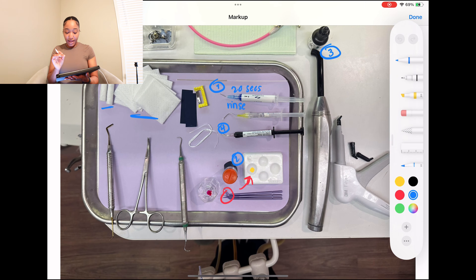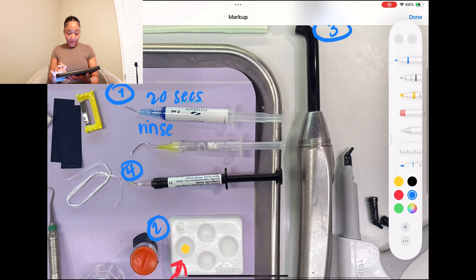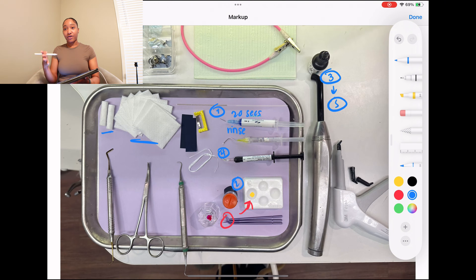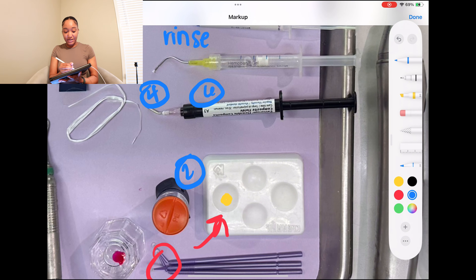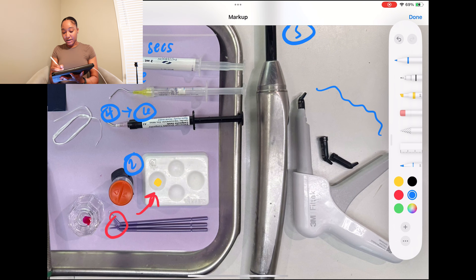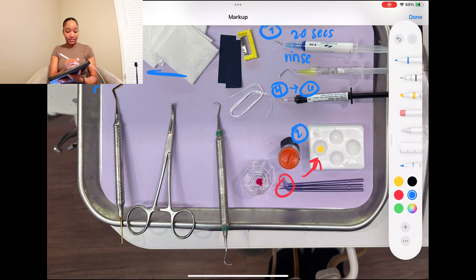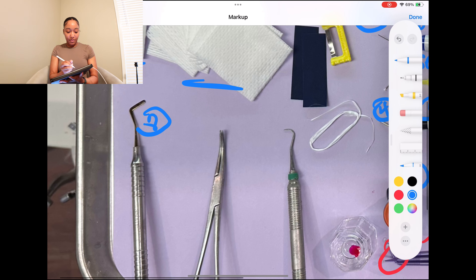After the flowable is placed and put into position, you're going to go back with the curing light — step five. You want to cure and polymerize that flowable. After that's done, your dentist is probably going to ask for flowable again — that's step six. And after that, this is when we get our packable — step seven. Once the packable is placed, this is when you need your PFI — that's step eight.